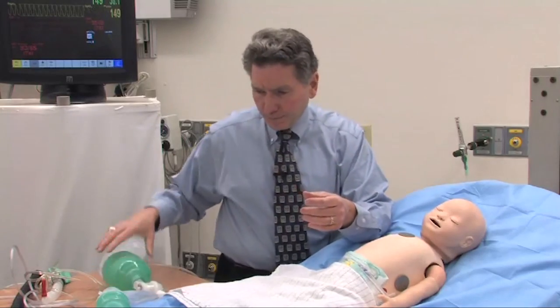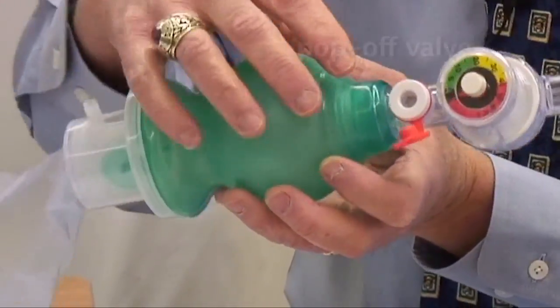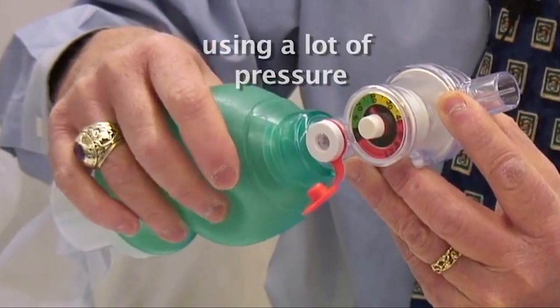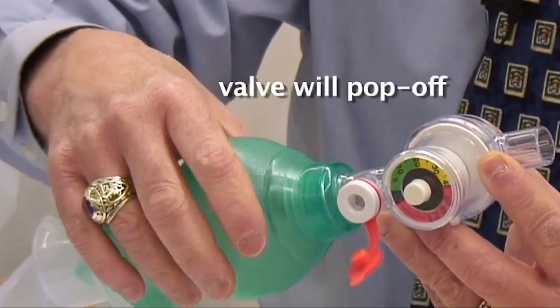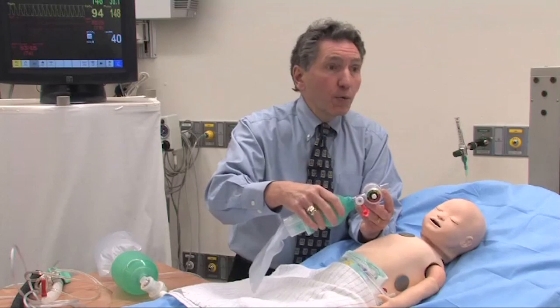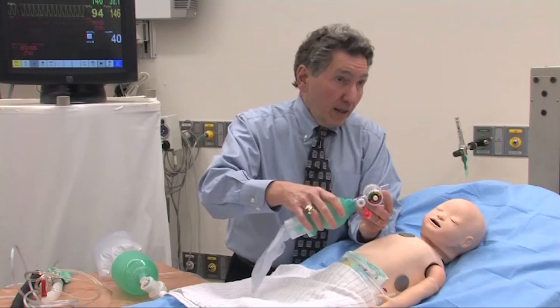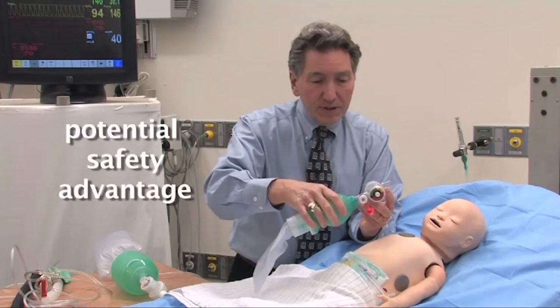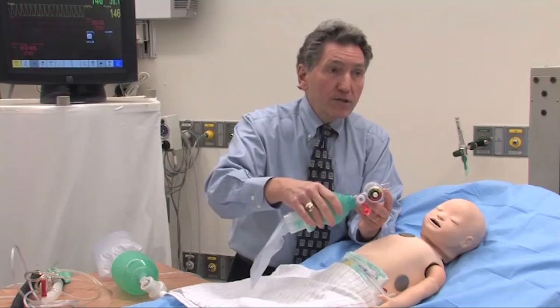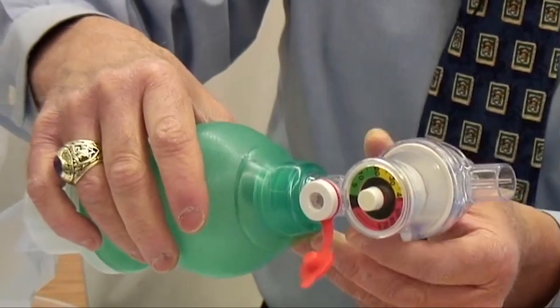These bags may have what's called a pop-off valve. If I'm ventilating the patient using too much pressure, this valve will pop off — typically at around 40 or 45 centimeters of water pressure. The reason is so that I won't accidentally give the baby a pneumothorax from using too much pressure. That's a potential safety advantage. But the disadvantage is if I need more than 40 or 45 centimeters of water pressure — for example, a baby with a difficult airway or an asthmatic who's particularly tight — the pop-off valve will prevent ventilation unless I can defeat it.